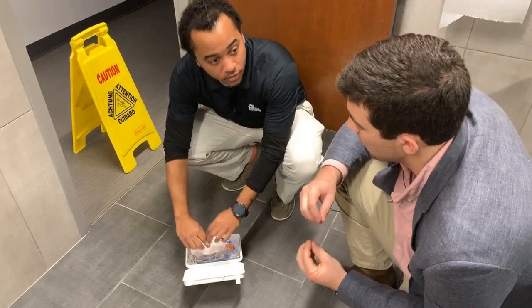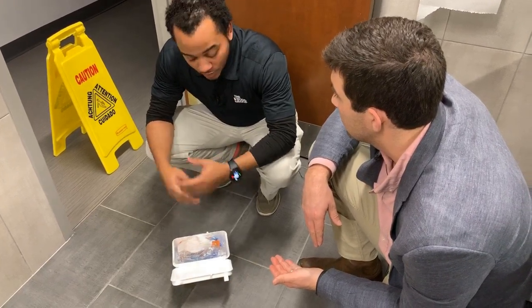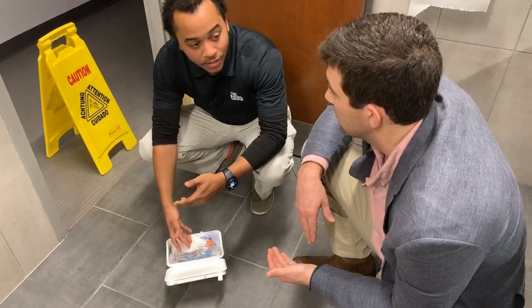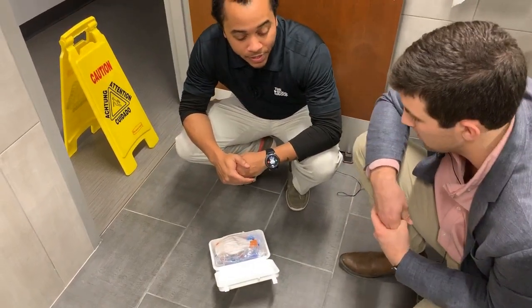Now I heard you say break it open. So what happens if this kit's already been opened? Well, if it's already been opened, then we need to take precautions and get another kit, because this could potentially be contaminated already. Okay. So we need to be using a new kit. Sterile. Okay. Got to make sure it's sterile. Correct. Gotcha.